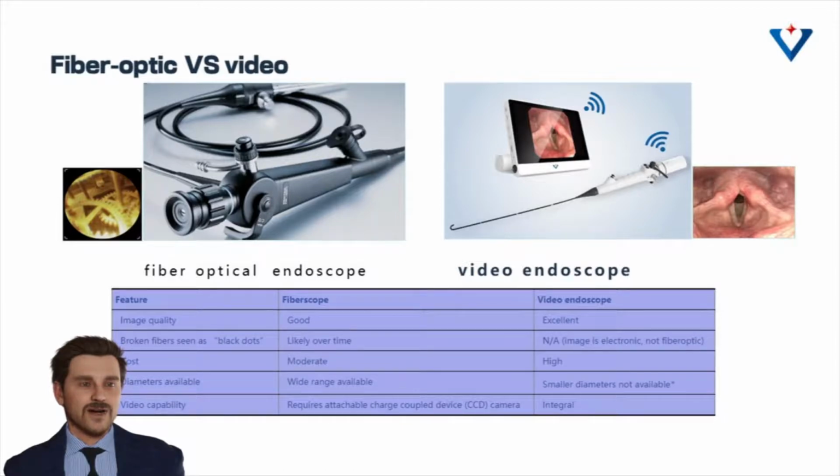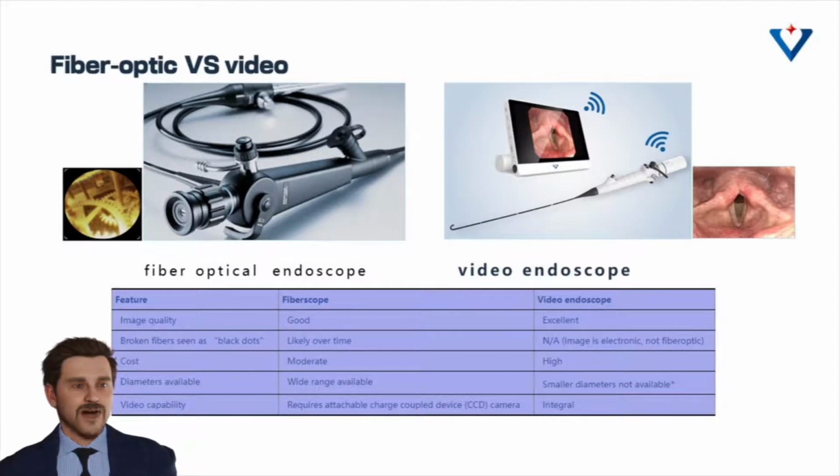Durability. The fibers in fibroscopes are thin and fragile. The fact that they are made of glass doesn't help matters either. In other words, they can easily be damaged if not handled properly. There is also a way for you to find out when your fibroscope has been damaged. Any damage will be exhibited as black dots, and you will also experience a decrease in the quality of the projected image. The presence of fiber optic strands is also the reason for limited articulation capability, spanning no more than 90 degrees.